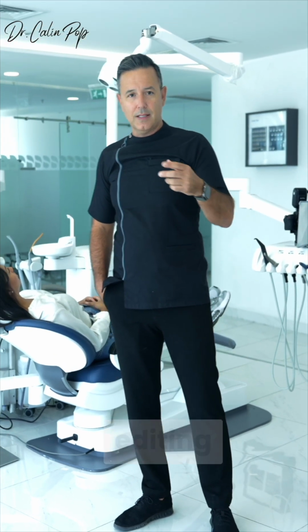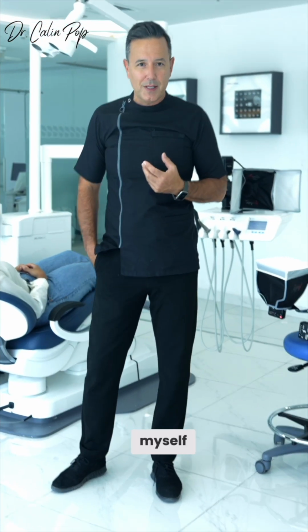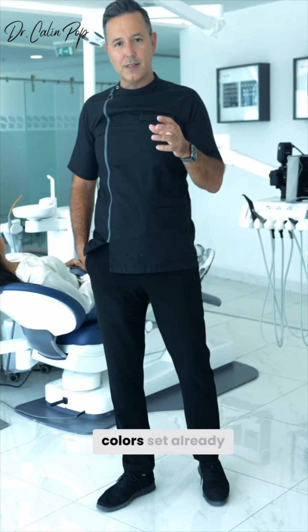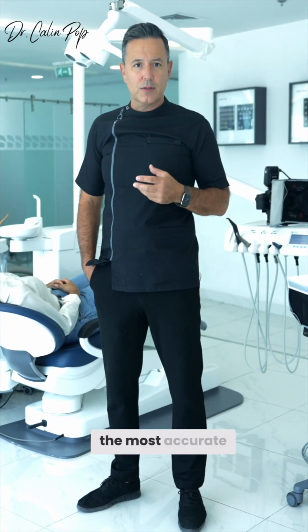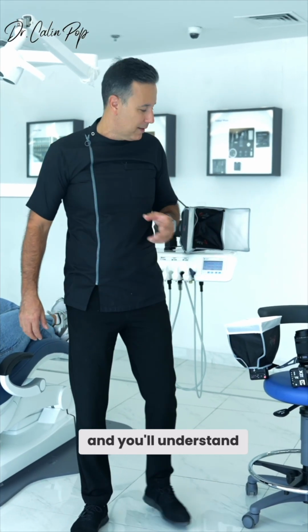Instead, you can do the editing in Lightroom or Photoshop. So if you have time, you can do that. If I speak for myself, I don't have time to do it, so I prefer to capture a photo that has proper colors set already in the JPEG file. So what I prefer to use is the standard picture profile because it provides the most accurate representation of the colors. So let's shoot a couple of photos and you'll understand everything I just said.